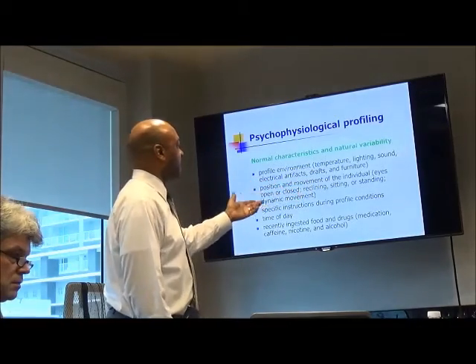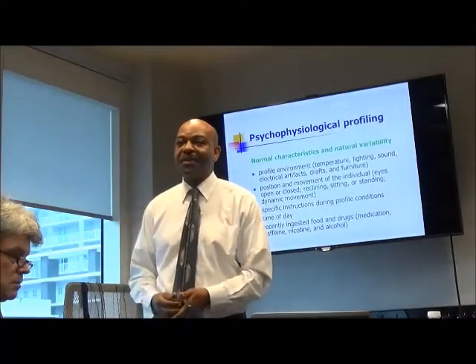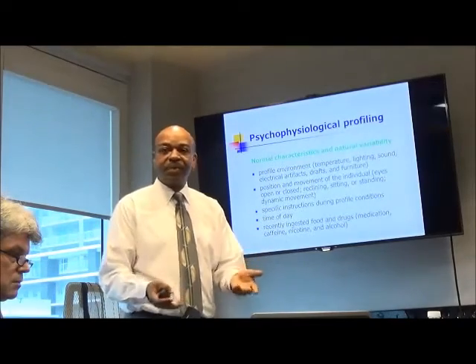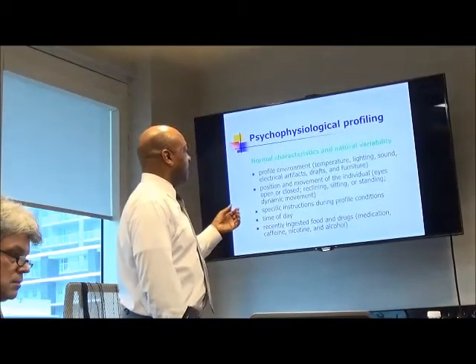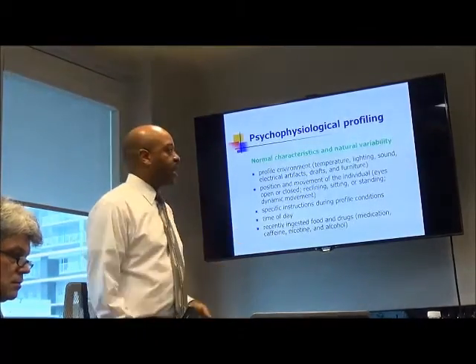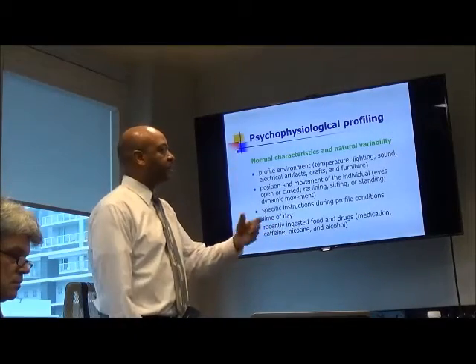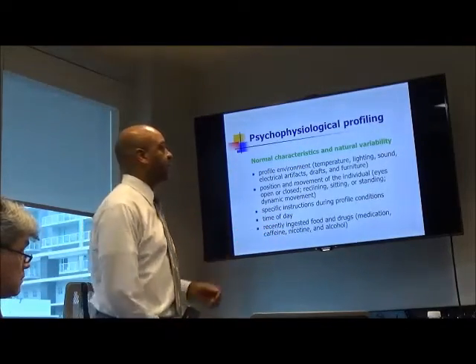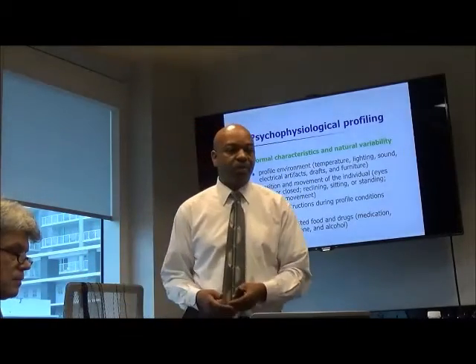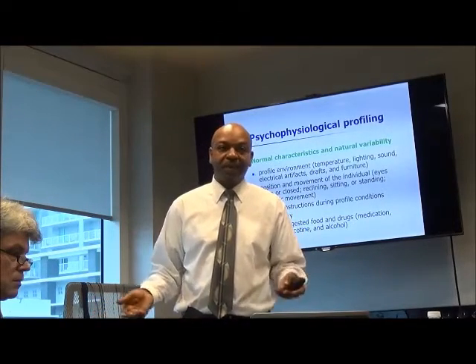Lighting, sound, like in this room right now, we have some construction sound going on and things like that. So that could be affecting if we were doing a stress assessment here. And electrical artifacts, so making our readings higher if the instrument is picking it up. Drafts, we talked about the air conditioning vent, or if you have an open window, anything like that could cause a draft. Furniture. So if you're using a chair, normally most people would consider this, but if you had a chair that's very uncomfortable, that could cause a problem.